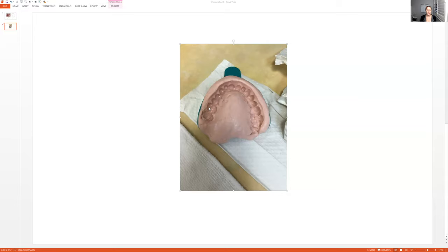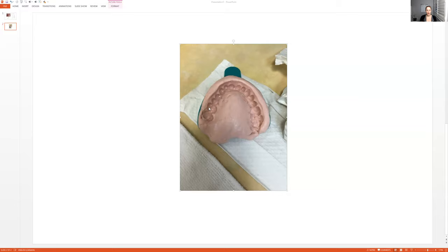So then tell them you are mixing up the tray for the bottom. I still fill up the water to number three and then I do three scoops of alginate. I couldn't think of the word for a second. Because then that way I don't run out of material because there's nothing worse than putting the material in the tray and then going, oh shoot, I don't have enough. I just do three and three. You never have to worry about not having enough.